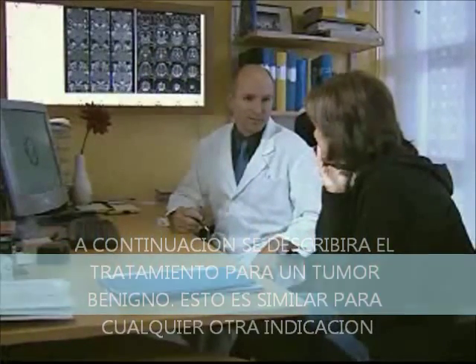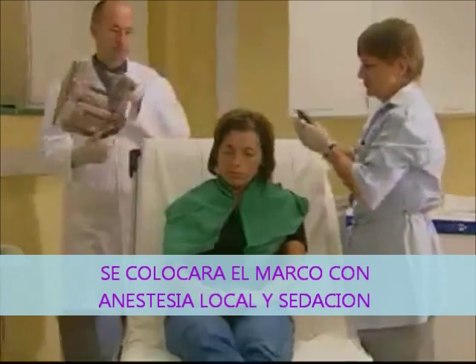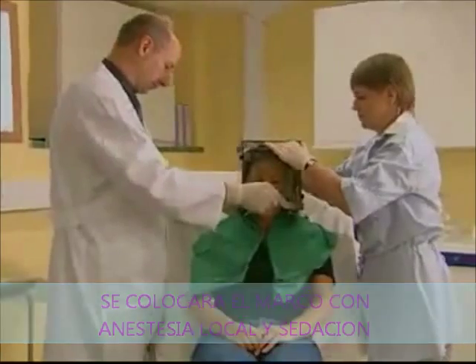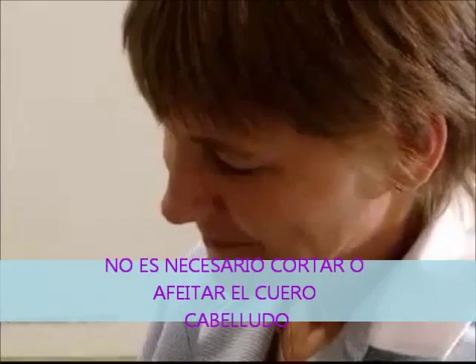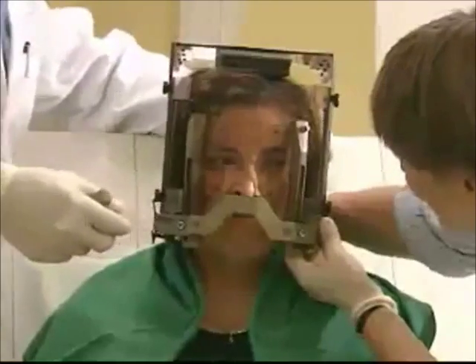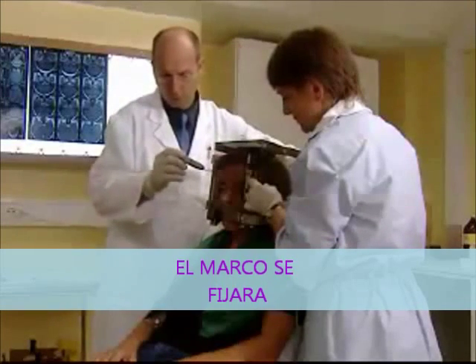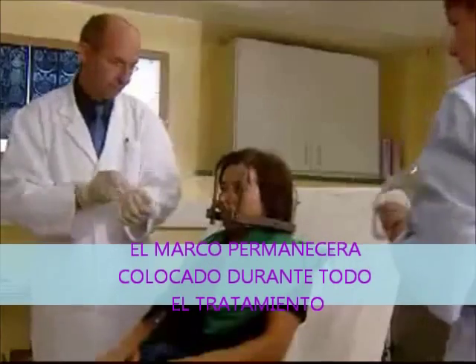Before treatment, your doctor will inform you about the entire procedure. To begin with, the lightweight frame will be placed on your head — your hair doesn't need to be cut or shaved. Local anesthetic is applied where the frame is to be attached. Once the anesthetic has taken effect, the frame will be fixed to your head with four screws. The frame remains on your head throughout the entire procedure in order to keep your head in a stable position during imaging and treatment. Attaching the frame takes about 15 minutes.